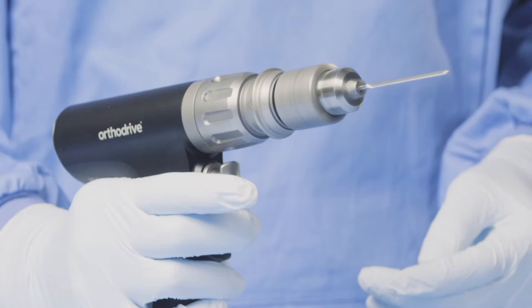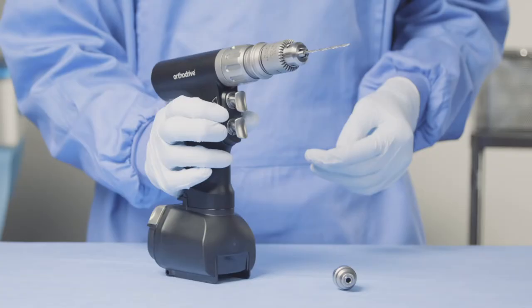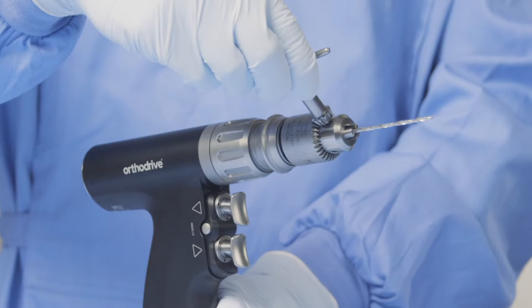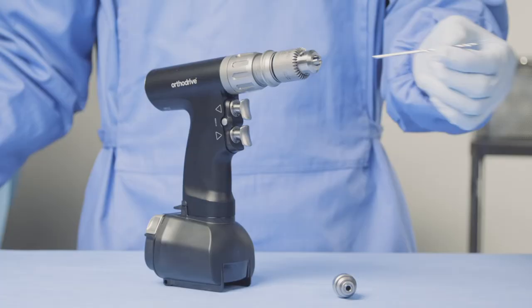and you can drill. Place the tool back into safe mode. To remove the drill bit, take your chuck key and this time turn in an anti-clockwise direction. You can then slide the drill bit straight out and remove the attachment, like so.